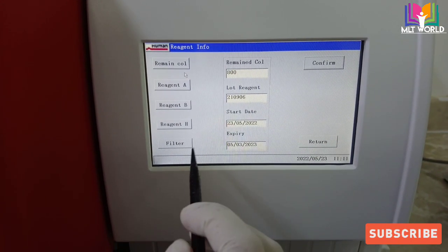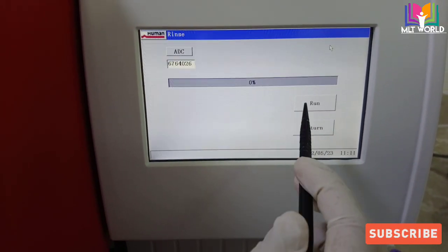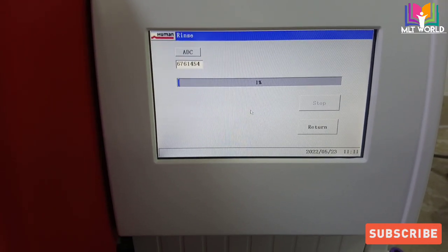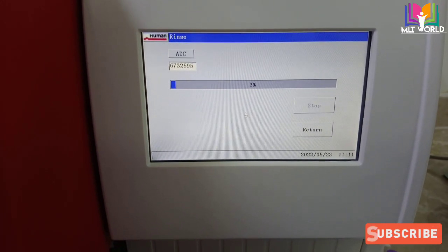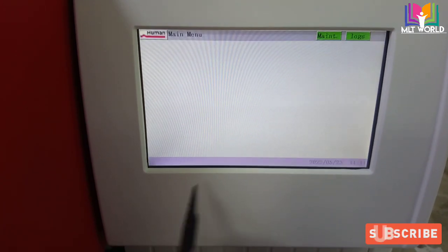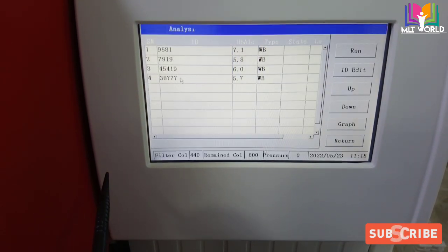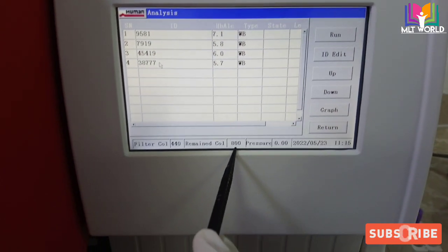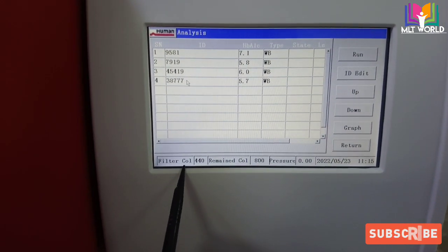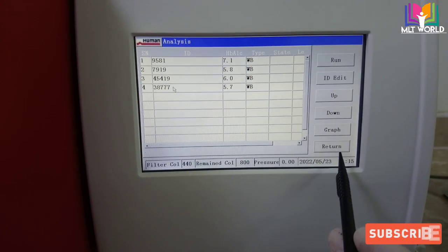Again go to Reagent Information and now confirm the filter. Click Confirm, then Run, and wait for 100%. After completing, return to the main screen. Now you can see that the remaining column is updated to 800, and the filter is updated to 440 tests — I mentioned 400 earlier but the correct number is 440 tests.